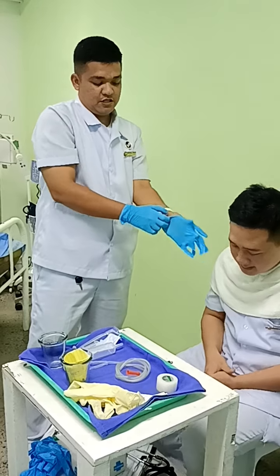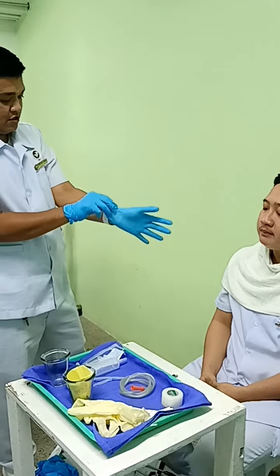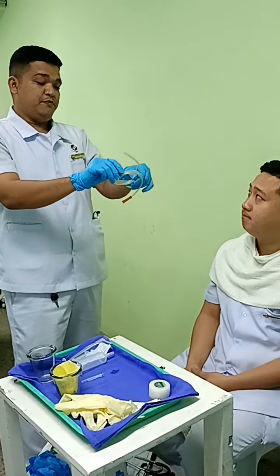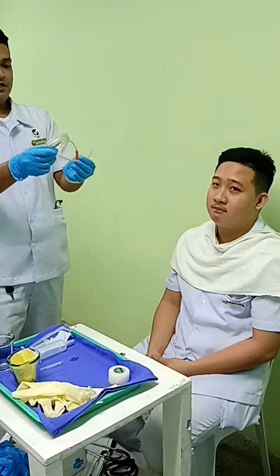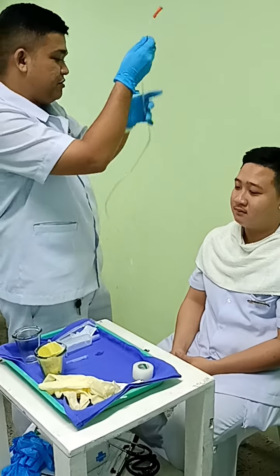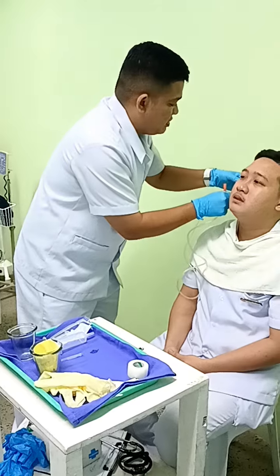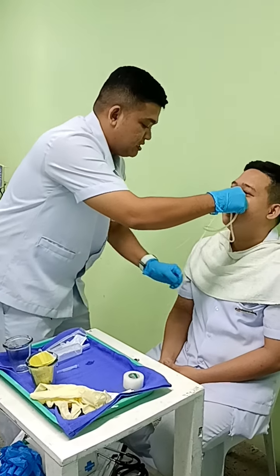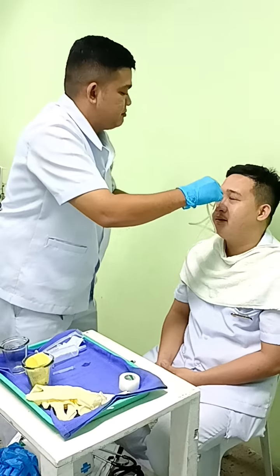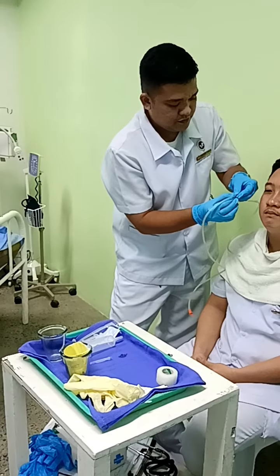For the next procedure, we are going to determine the length. Once you have determined the length, we have to place a tape to mark the tube. We take our tube and start from the nose to the ear, down to the xiphoid, and mark this with a plaster. Then we ask the patient to flex their head backward, and then we gently insert the tube.